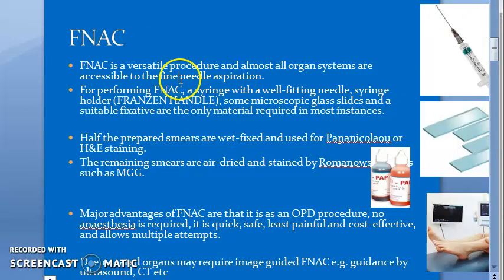So coming to FNAC. FNAC basically, what is it? It is a versatile procedure. You can use it for almost all organ systems which are accessible to the fine needle. So this is the fine needle. In this you can see 2 parts: this is the needle and this is the syringe, correct? Sometimes they just put the needle and by capillary action they can retrieve the cells. So you don't need a syringe for suction at all sometimes.